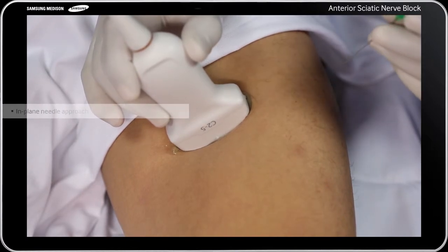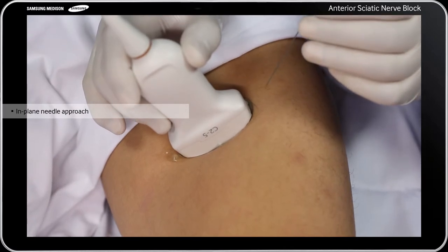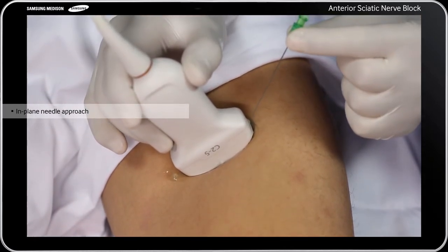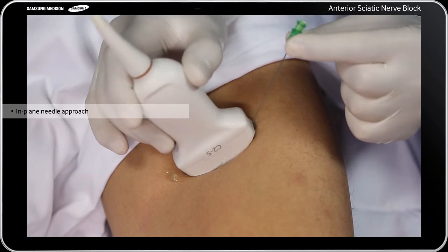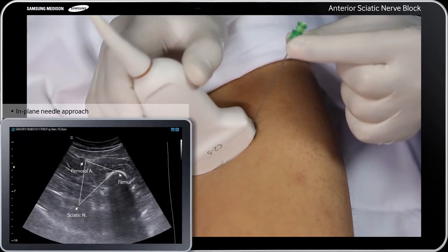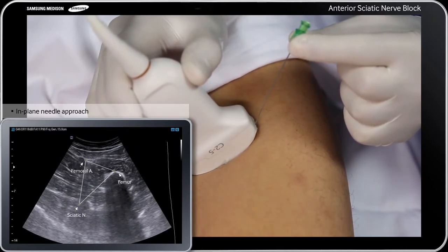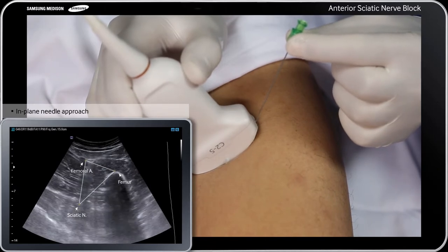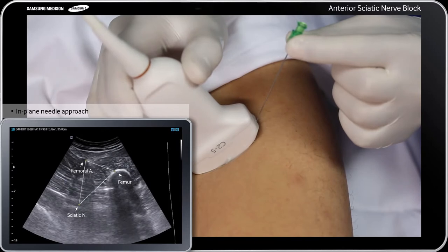For the in-plane approach, use an 8 to 12 cm, 22-gauge, insulated block needle depending on the thickness of the thigh muscles. Insert the needle on the medial side of the ultrasound transducer after local anesthesia. Advance the needle in the medial to lateral direction as well as the anterior to posterior direction, with the thigh externally rotated.